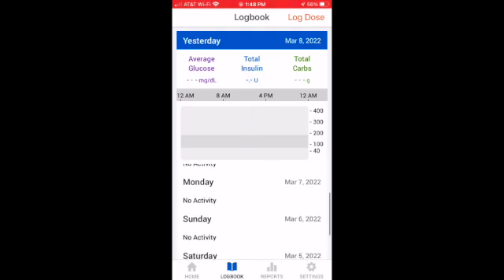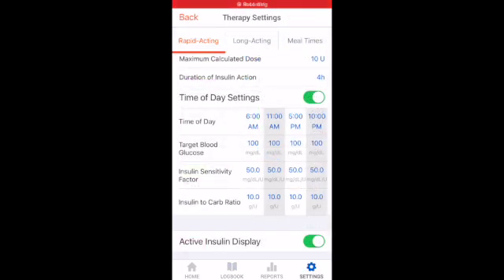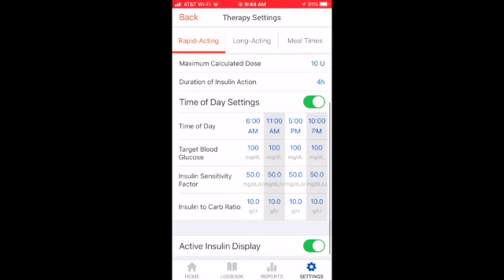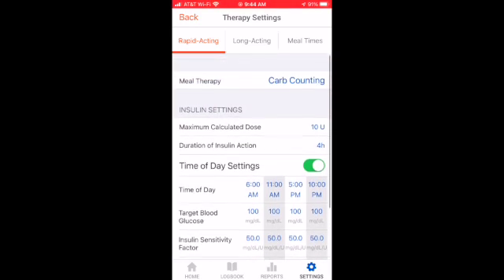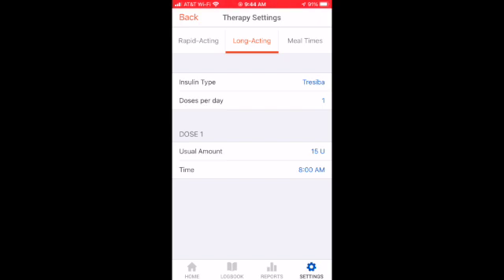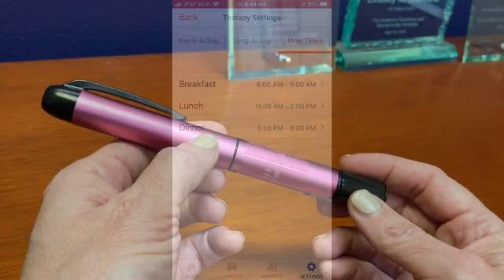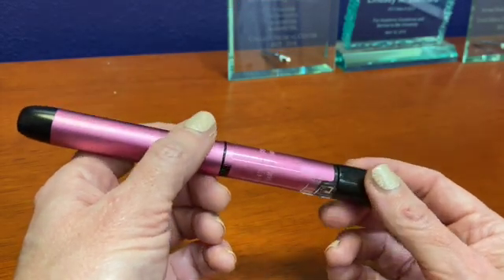The app can be customized with as much precision as we would customize an insulin pump. So if someone needs different carbohydrate or correction ratios at different times of day, we can do that. You can also set it to remind you when to take your basal insulin once or twice a day, and it'll keep track of your life for you.